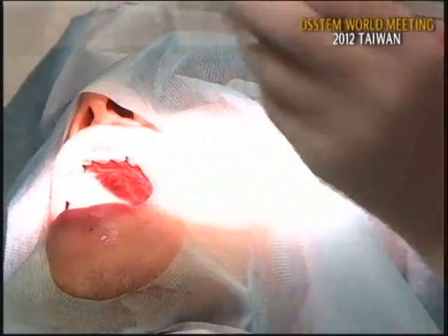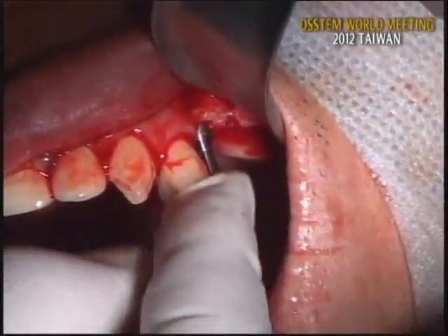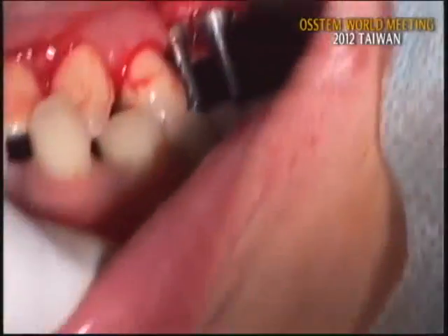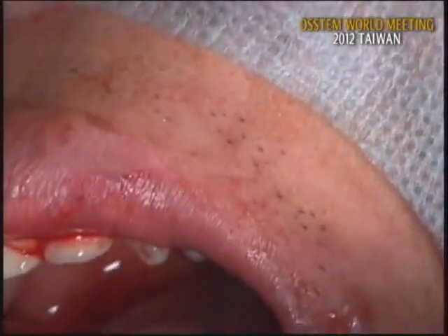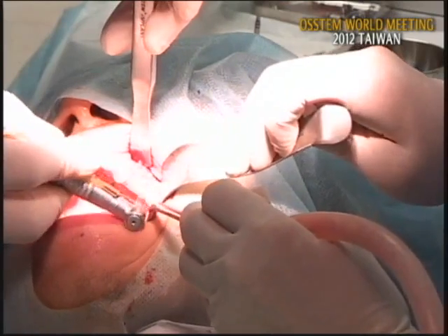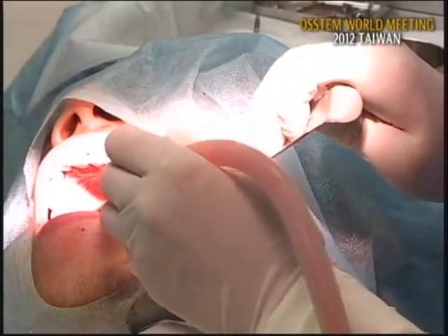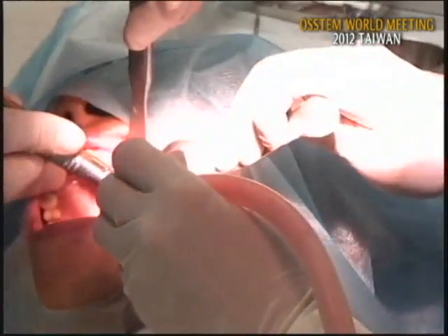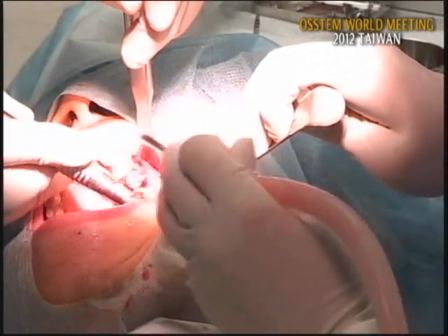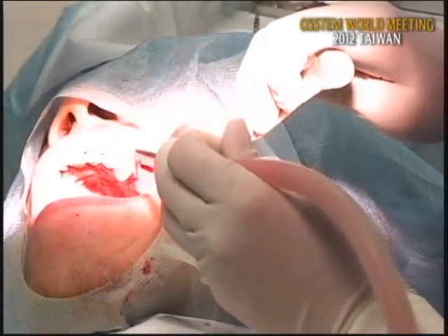Let me check the path of the implant. Here, this parallel pin is to check the implant position and the direction. Okay, close, please. Close. Okay, not bad. Open, please. Okay, I'll enlarge the hole. Open, please. 4.0 and here. Bone is normal density in this site.